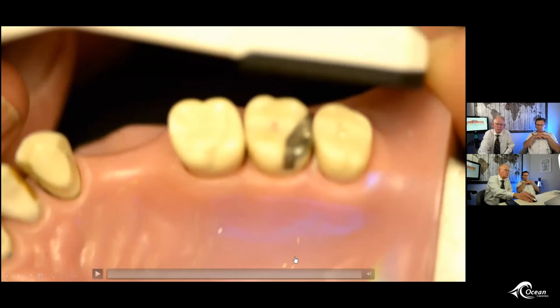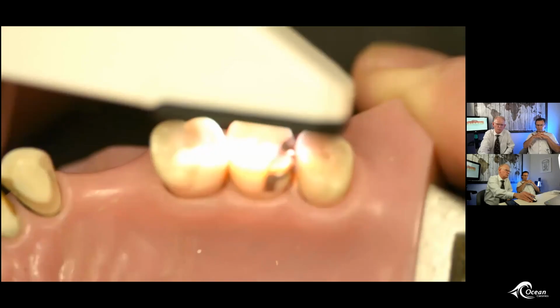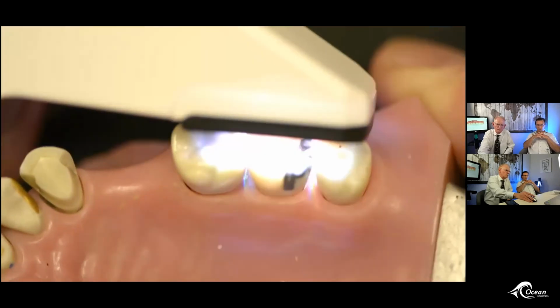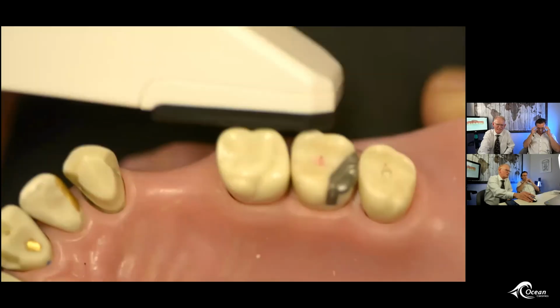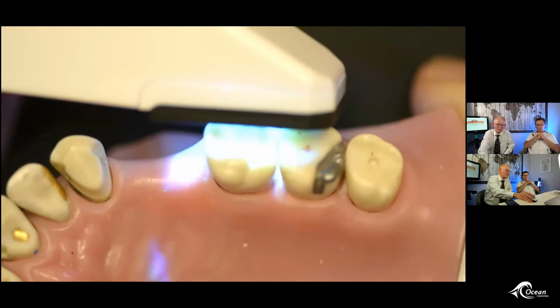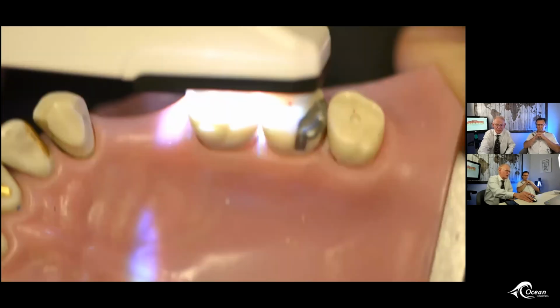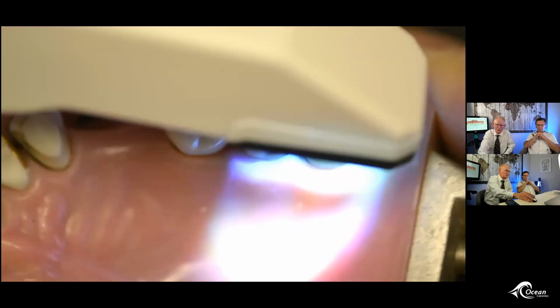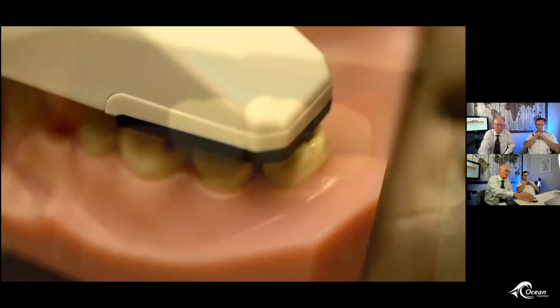Now what's coming up here? We're scanning. Oh, I never scanned. Sorry, Mark. See it closing. You can look away. This is not a video capture. This is single image stitching. And it still worked. It's still as accurate as what they've got available today. It's just a lot slower.